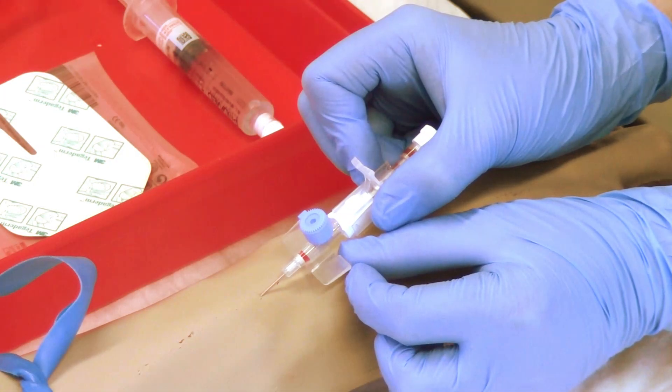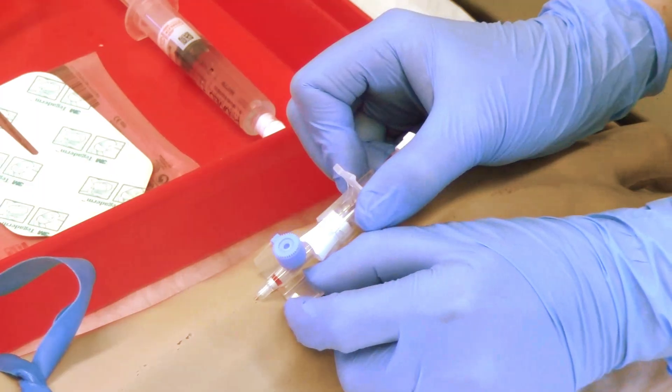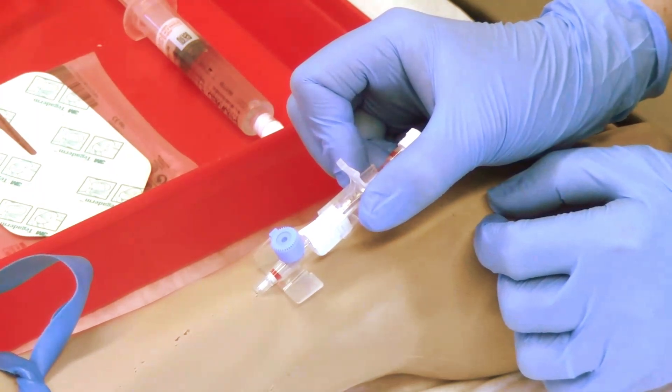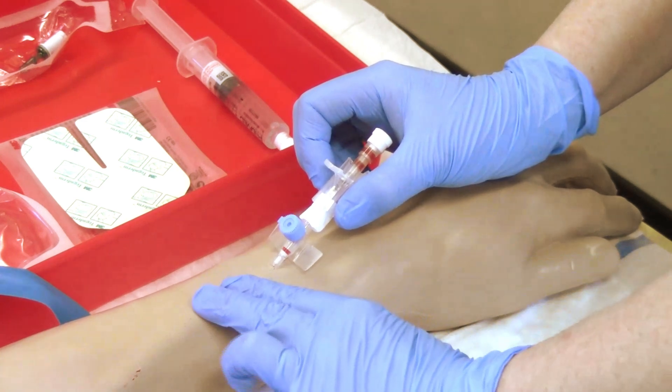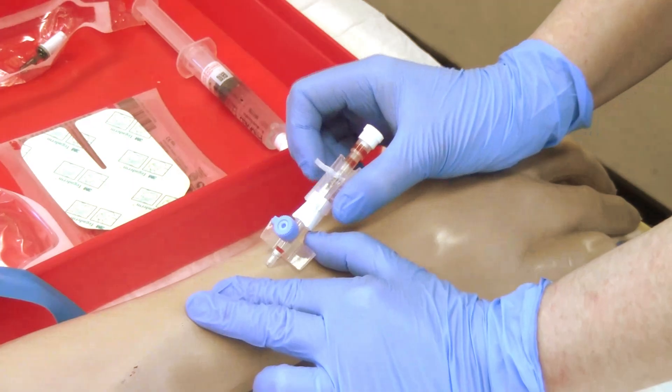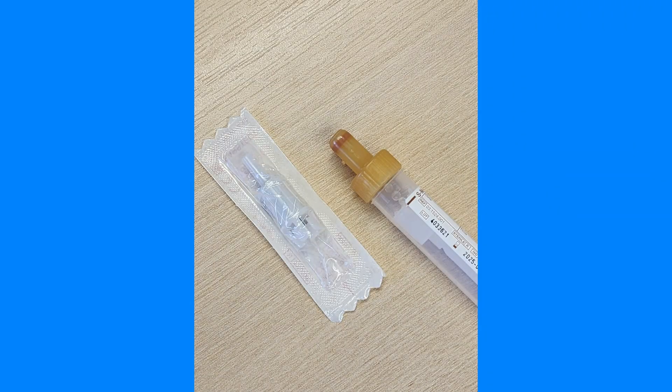Hold the stylet stationary with one hand and with the other hand advance the cannula forward off the stylet. Release the tourniquet. Apply digital pressure to the vein above the cannula tip, remove the stylet, and secure the primed extension set onto the end of the cannula. If bloods are required, this should only be done immediately after inserting the cannula and prior to flushing, by attaching the blood adapter to the end of the cannula, then attaching the blood tube and drawing blood.